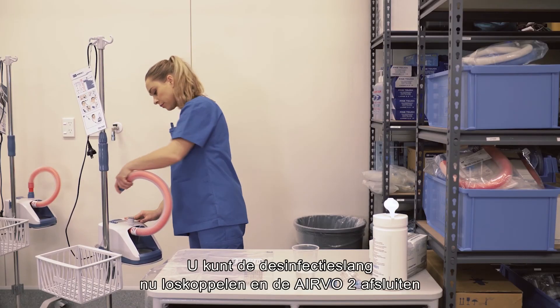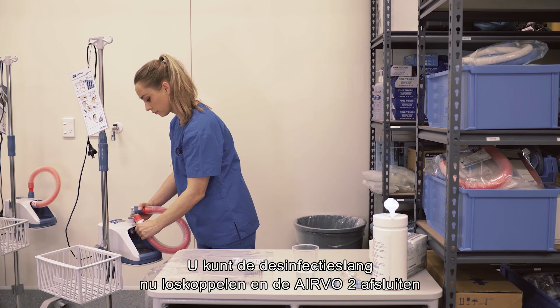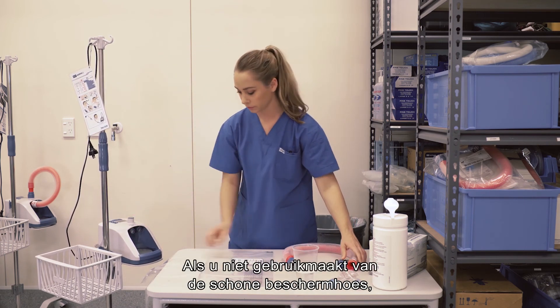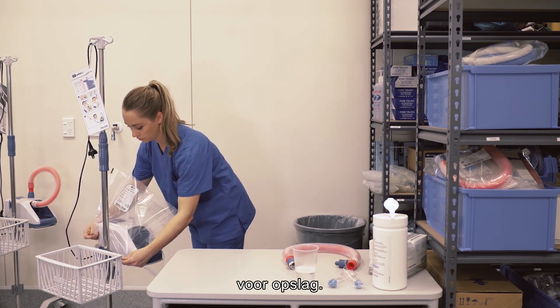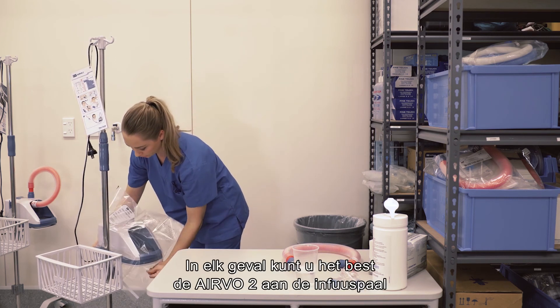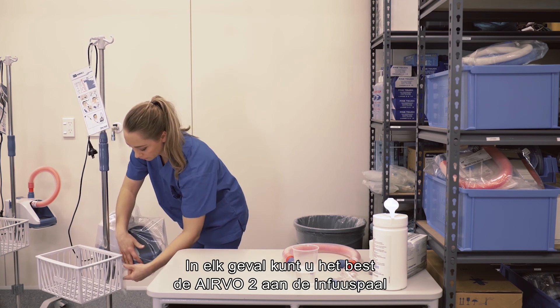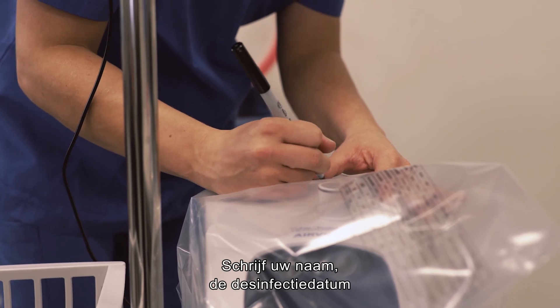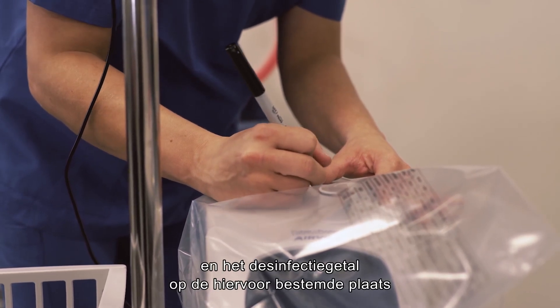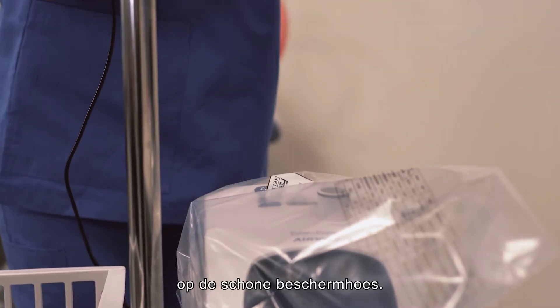You can remove the disinfection tube at this stage and seal the AIRVO 2 with a clean storage cover. If you are not using the clean storage cover, you may prefer to leave the disinfection tube in place for storage. In either case, it is best to leave the AIRVO 2 on the stand to protect it from bumps and knocks. Write your name, the disinfection date and the disinfection number on the space provided on the clean storage cover.